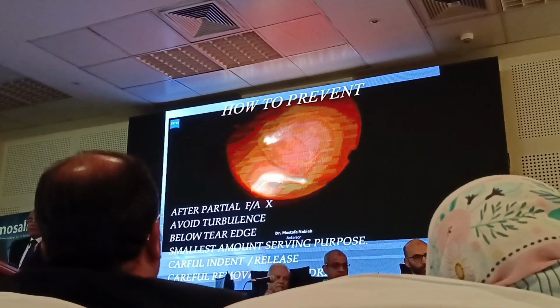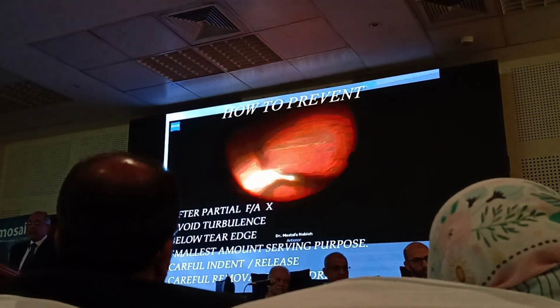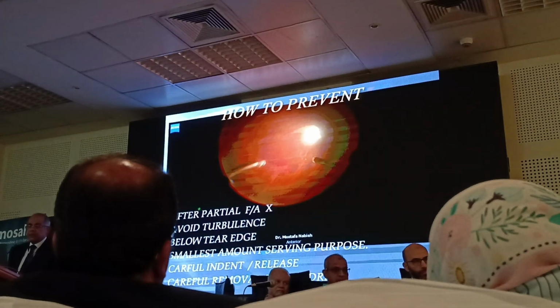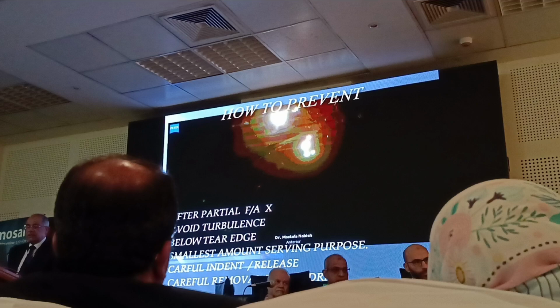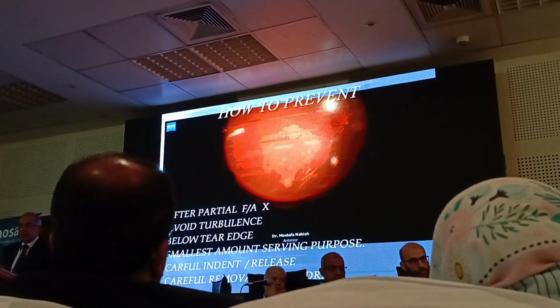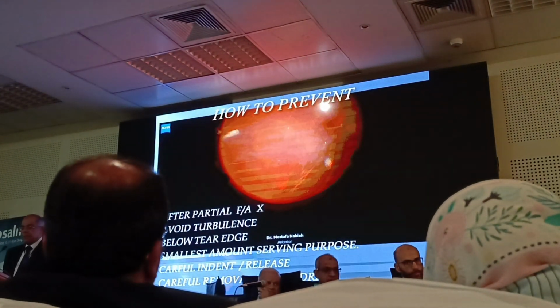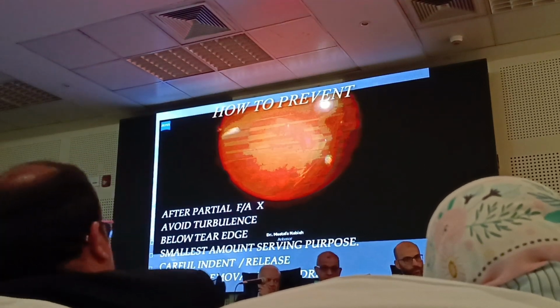Here I am starting drainage through the peripheral tear with the cutter. You see that air delineated the presence of vitreous gel that could be removed with the cutter. Then after complete removal of the peripheral vitreous, I used the rubber tip cannula to aspirate perfluorocarbon from the posterior pole, now having the retina almost completely dry.